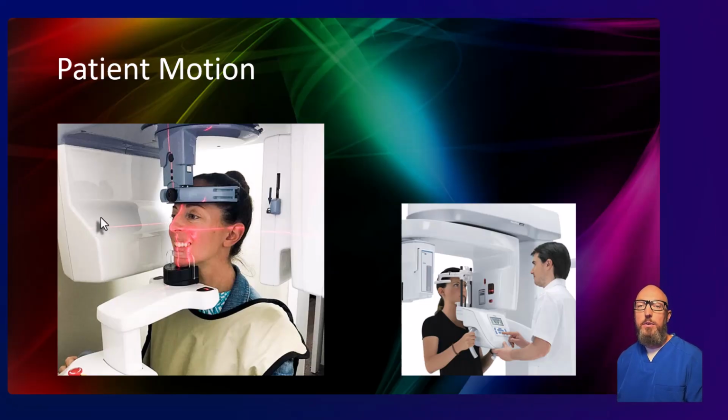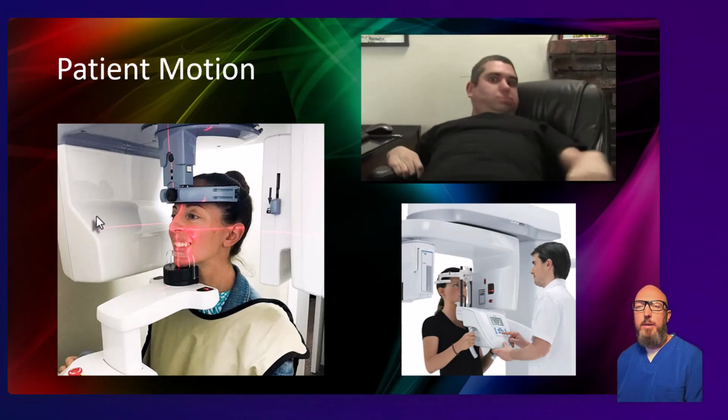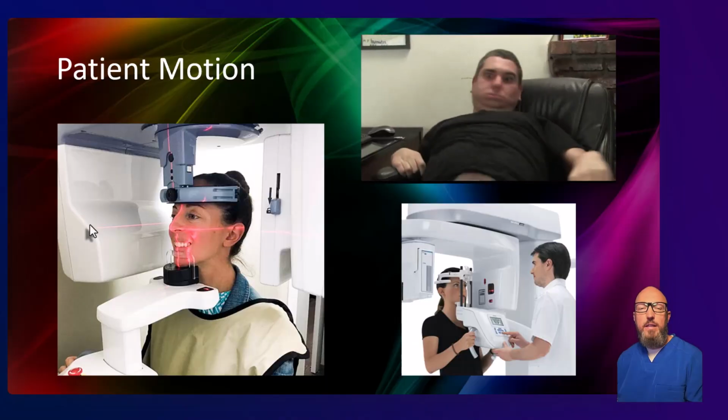Patient movement is the artifact that denigrates CBCT images more than anything else. So even patients who think they're holding completely still typically aren't. Sometimes they look like this, but hopefully not that bad. Studies have shown that teeth actually move in sync with the heartbeat up to 80 microns, so small movements are inevitable. But big movements like this are going to ruin the scan completely.